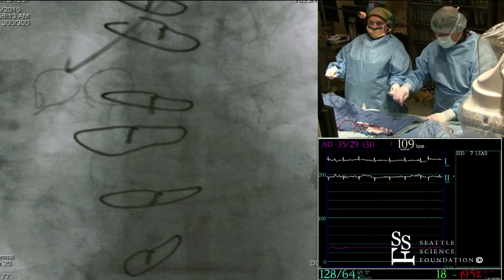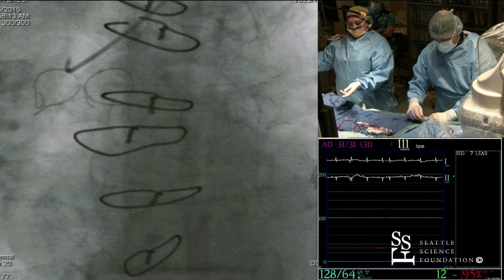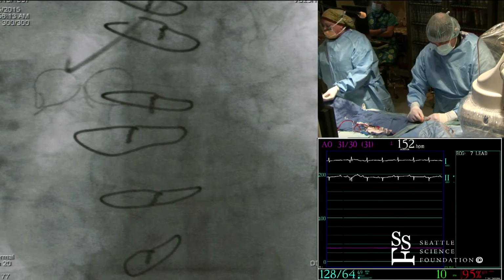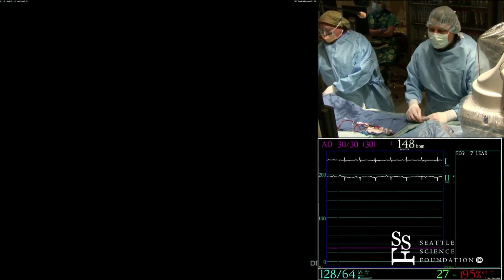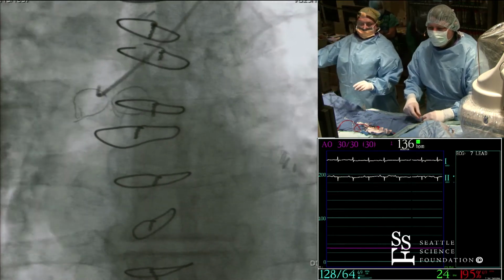So when I'm doing graft cases, I typically will look at the Lima first. So I got the wire up in the subclavian area. I just go ahead and stop there, and I go ahead and shoot the Lima, then exchange out and go down. And yeah, you're right. We probably could have just looked at the IMA there before I went down. I'm kind of regretting that given the tortuosity.